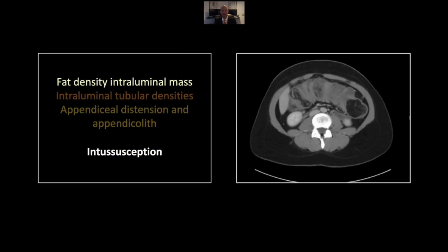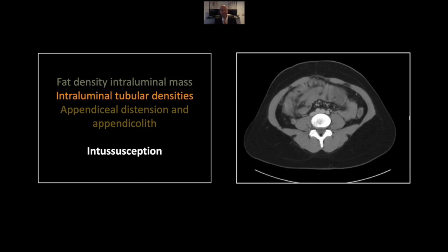We'll begin with a case of intussusception. Of course, in adults, intussusception usually is accompanied by a lead point lesion, and this one is a classic. A lobulated fat density here in the colon, which represents an intraluminal lipoma. In the next cut down, you can actually see tubular structures within the lumen of the colon, which represent intussuscepted small bowel and actually appendix alongside it.